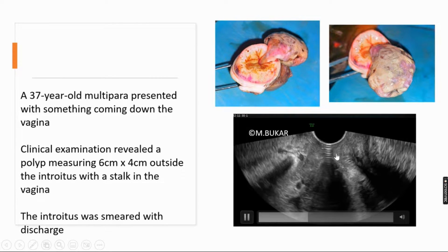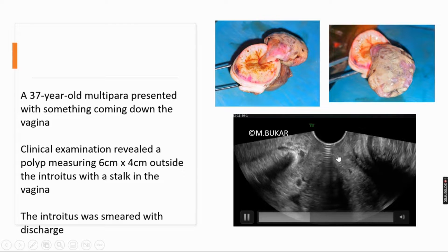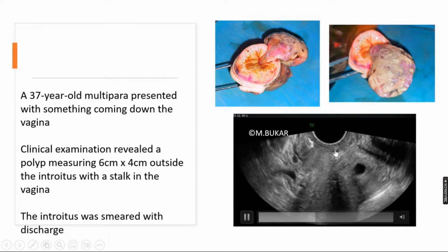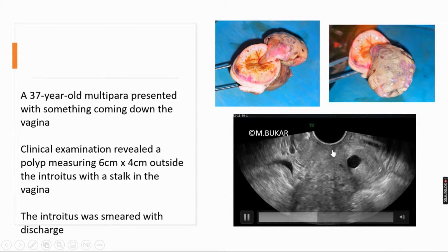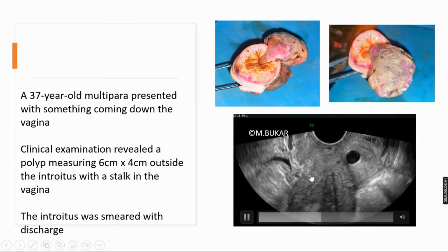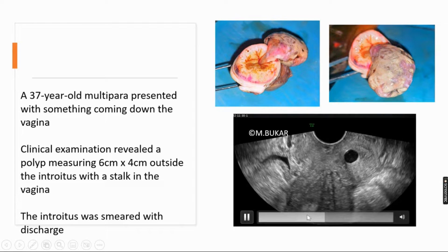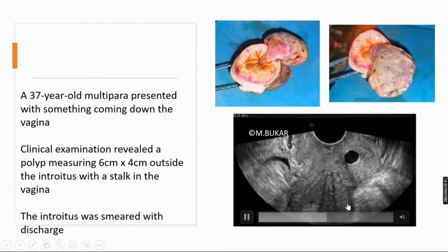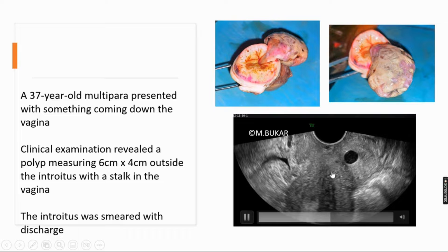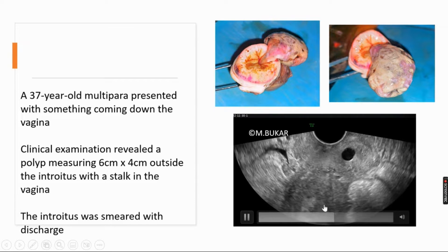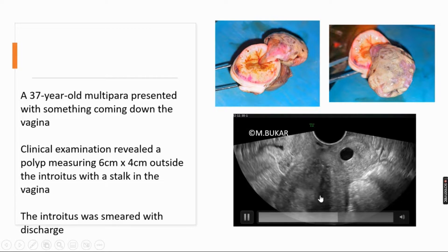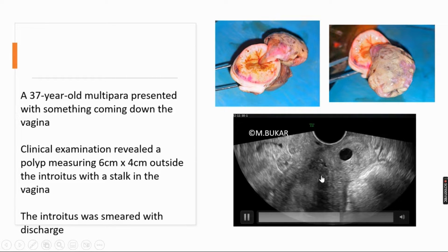This is the posterior vaginal wall. Here you can see fluid and the stalk. Note the axial position of the uterus and the heterogeneous contents in the endometrial cavity.